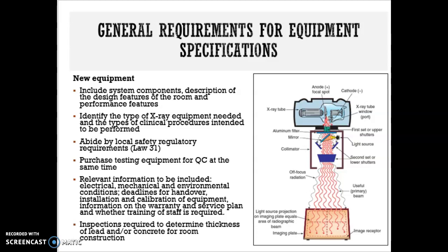Other relevant information includes details concerning the equipment installation, its calibration, associated deadlines for handover and installation, the warranty and service plan, and whether the training of staff is required from the manufacturer. Now, purchase of medical imaging equipment is expensive, and it becomes essential to ensure that the desired design and the level of performance is obtained in a cost-effective way while meeting the facility's needs.